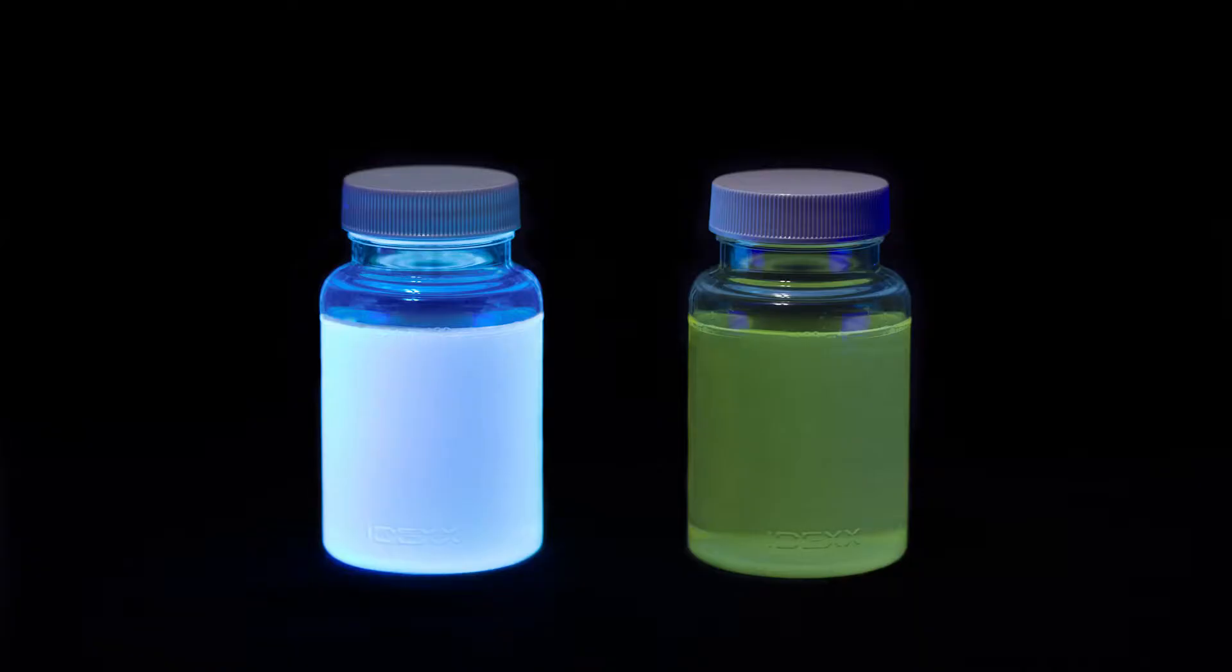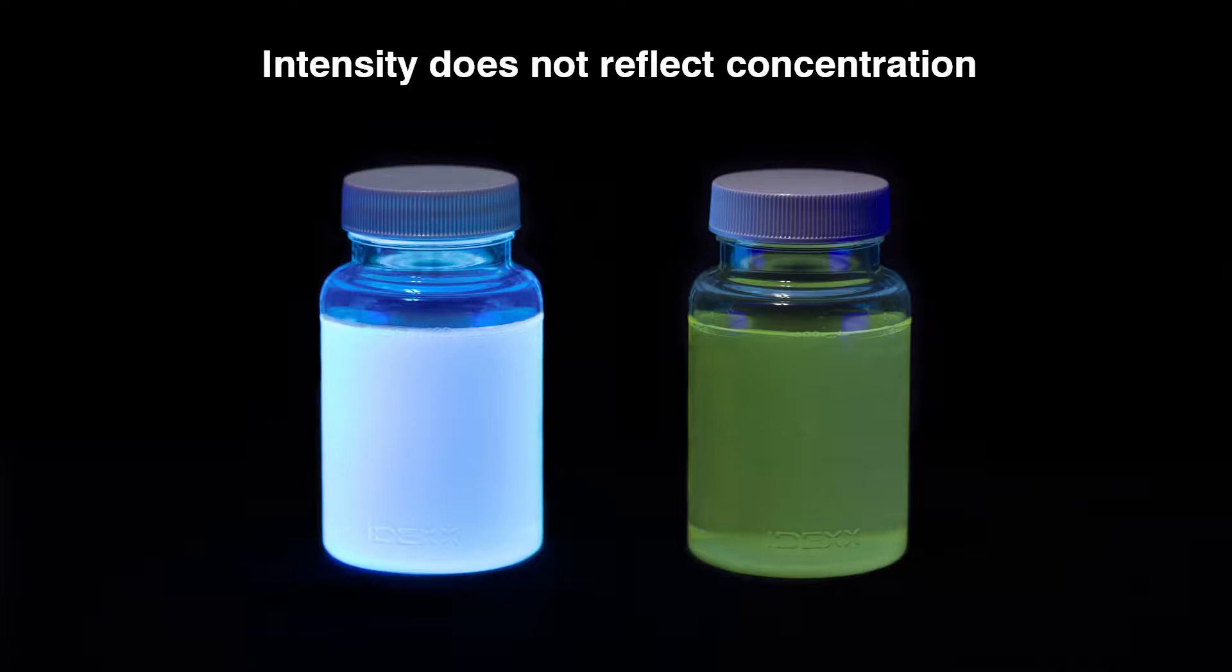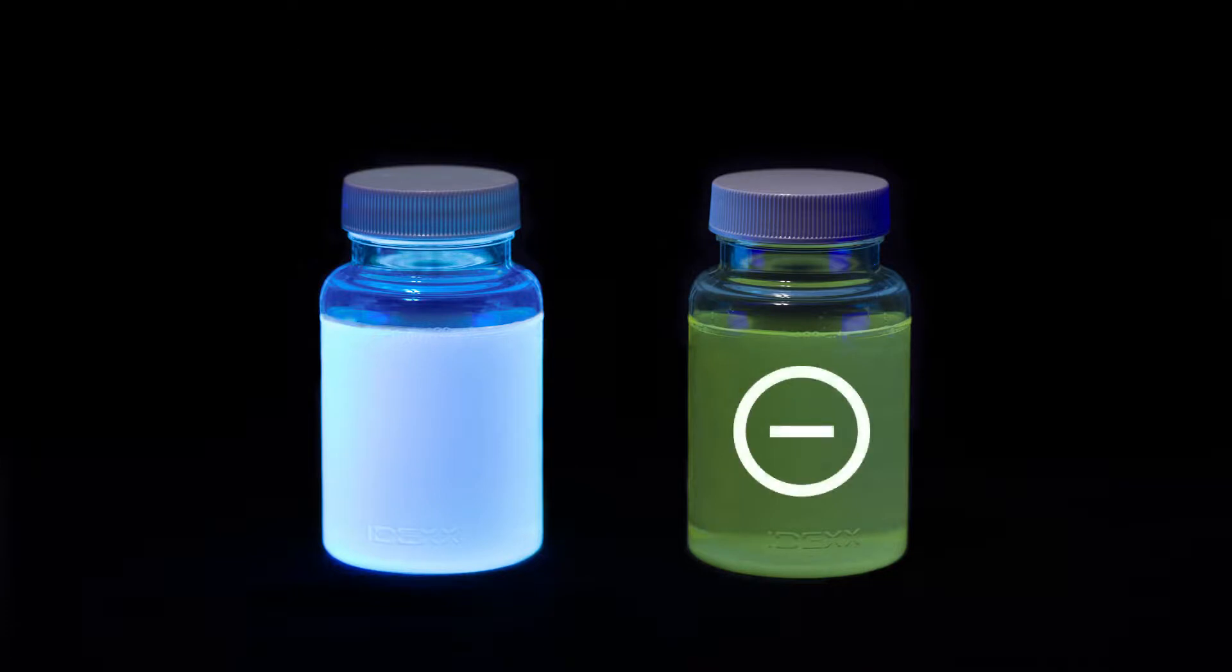After incubation, view the sample under UV light in a dark environment. Shine the light away from your eyes. Keep the light within 5 inches of the sample. Any blue fluorescence means a confirmed positive for enterococci. The intensity of the fluorescence does not reflect sample concentration. In this example, the right sample is negative and the left is positive.